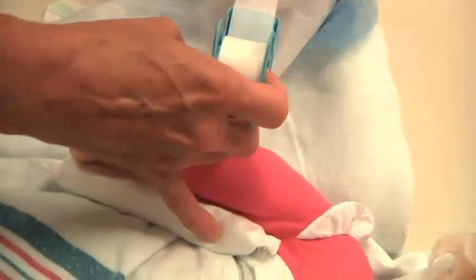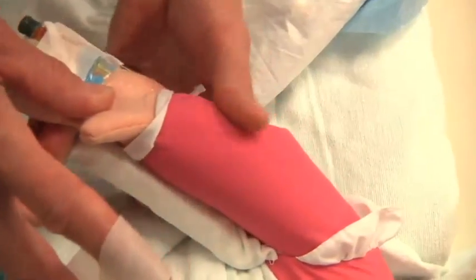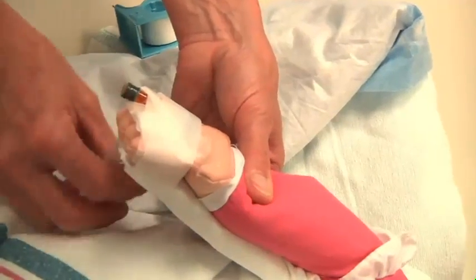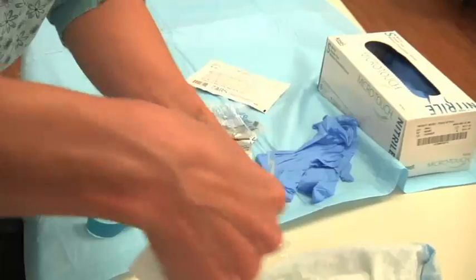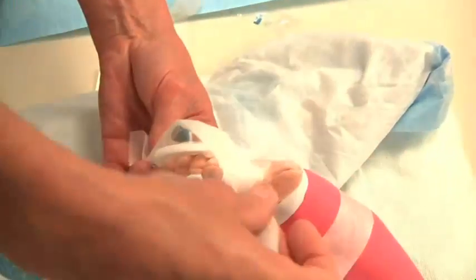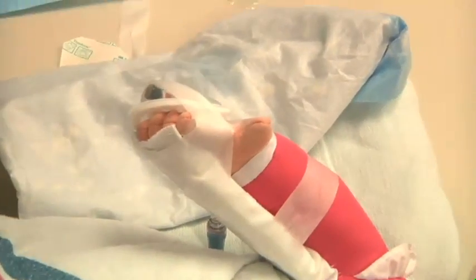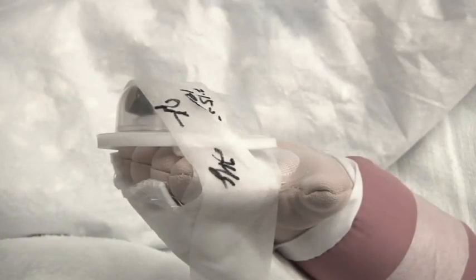Add the padded arm board, making sure that the fingers are over the end of the board. You may use an additional device called the house to protect the end of the T-connector, placing it over the end and taping it with paper tape. Lastly, you want to label the PIV with your initials, the date, the time.